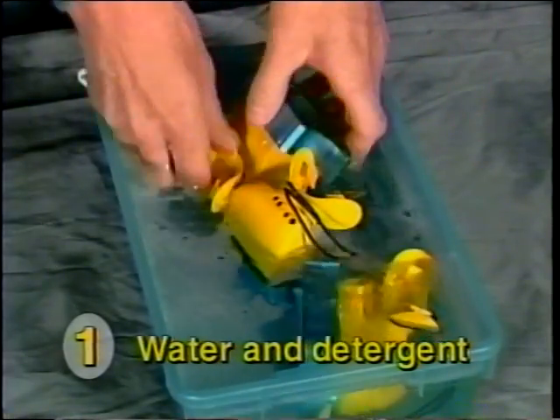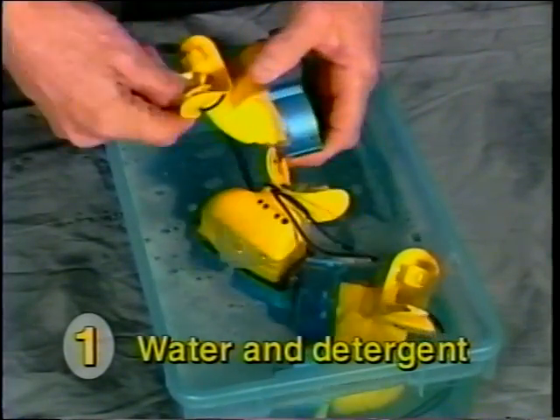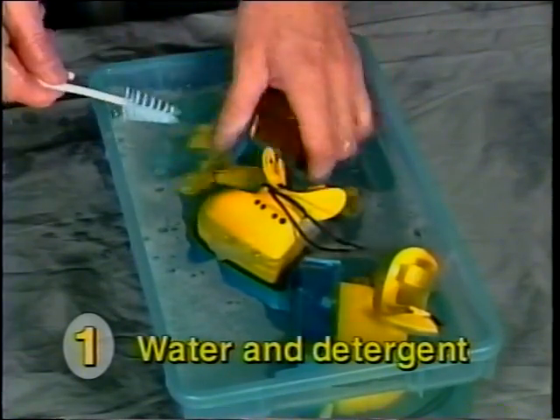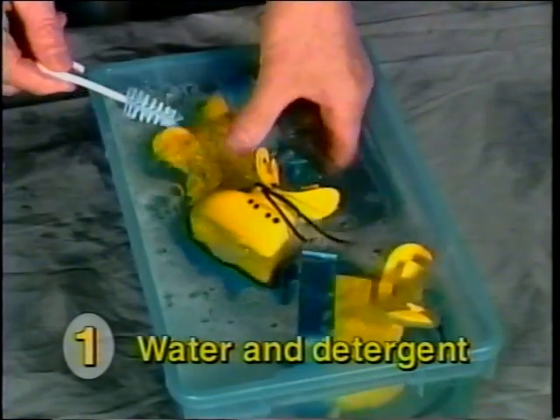Clean and disinfect the mouthpiece. Place it in the first tub containing water with detergent. Clean the inside and outside of the mouthpiece to remove all saliva and debris.